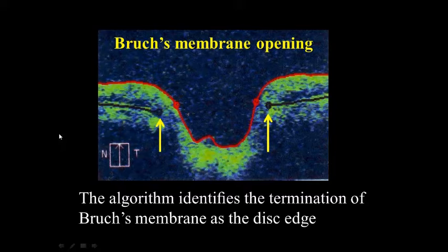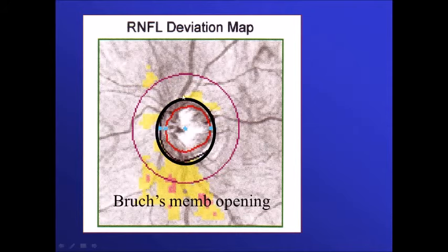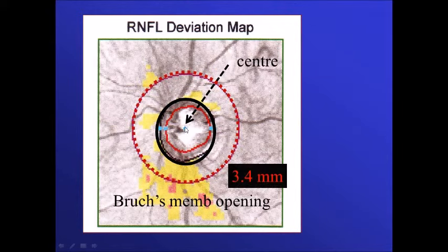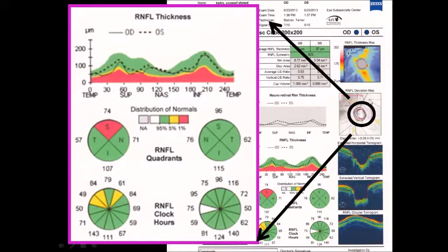The machine checks the end of Bruch's membrane to define the limits of the disc, then locates the center of this area and draws a circle with a diameter of 3.4 mm from the center. The thickness all around this ring is measured and displayed for both the right and left eye. If the thickness is within the normal range it falls in the green zone, but if abnormal it falls in the yellow or red zone.